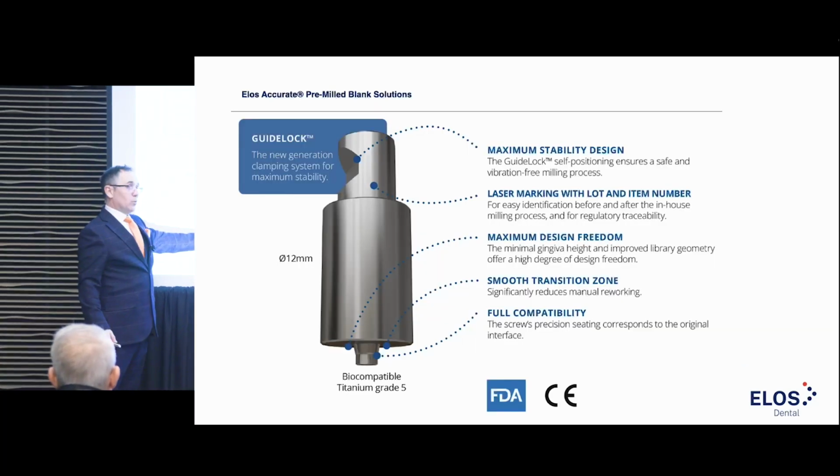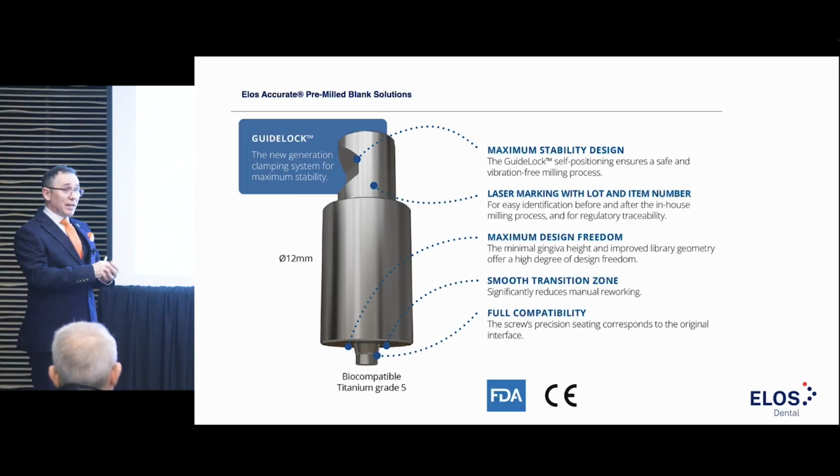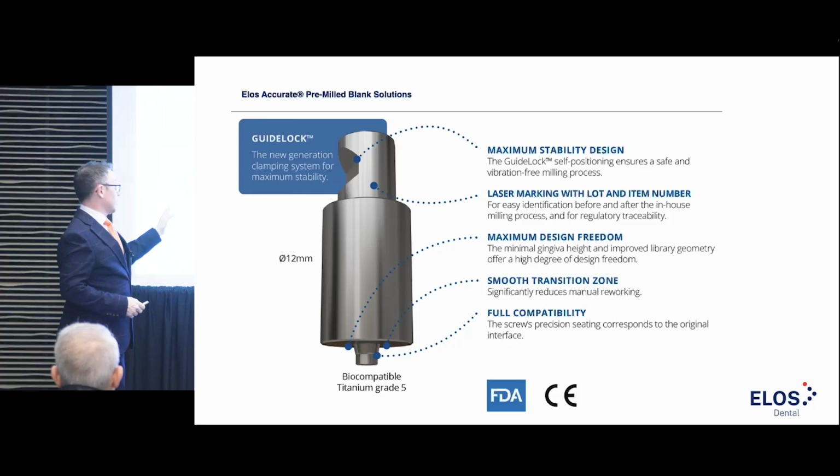I do not want someone milling me the interface. I want these as a pre-mill because I know that has been validated. I know it's a great engineered fit, and I don't like it when it's coming out of a disc mill because that is not completely controlled, whereas I know this is, so I've got peace of mind.